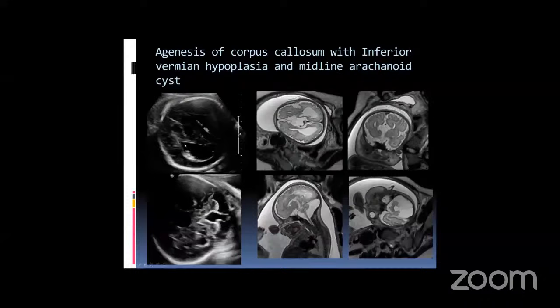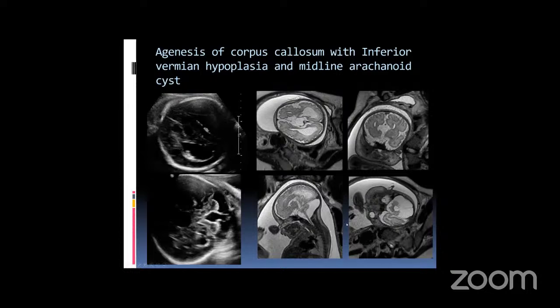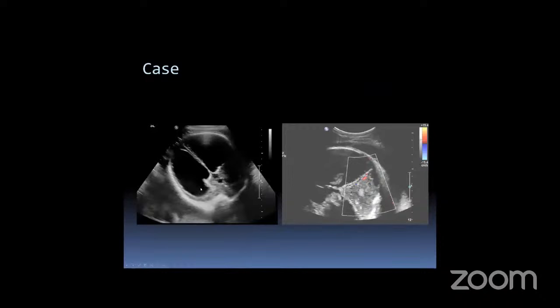On MRI we confirmed absence of the septum pellucidum and an abnormal posterior fossa with notching and absence of the vermis — this was severe vermian hypoplasia. In addition this baby also had a midline arachnoid cyst. Another patient came in with hydrocephalus in later pregnancy after normal first and second trimester ultrasounds, with an echogenic posterior fossa. MRI showed that the hydrocephalus was caused by a large posterior fossa tumor obstructing outflow, with herniation into the upper spinal canal.